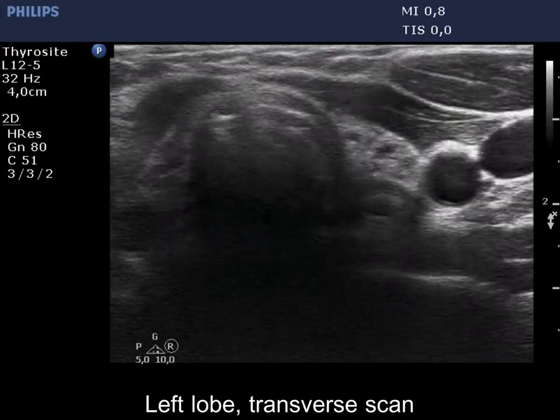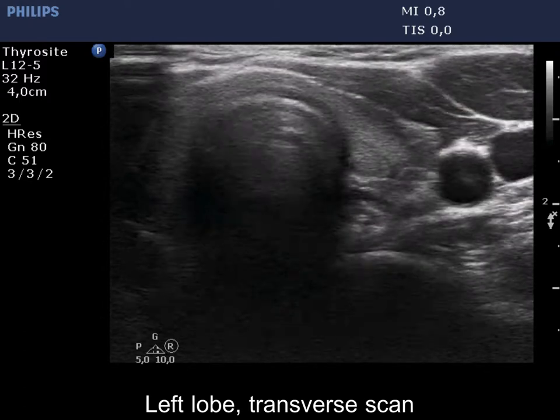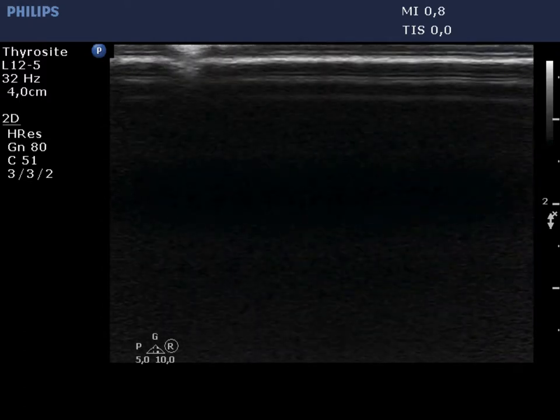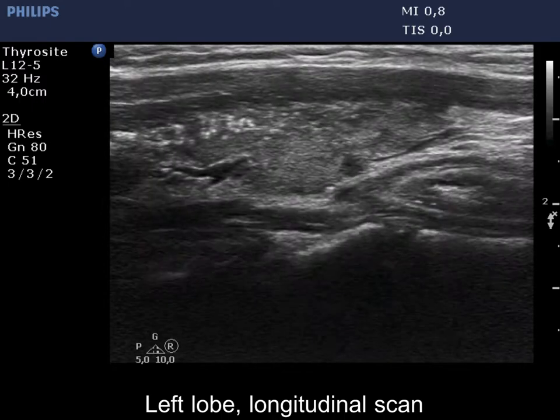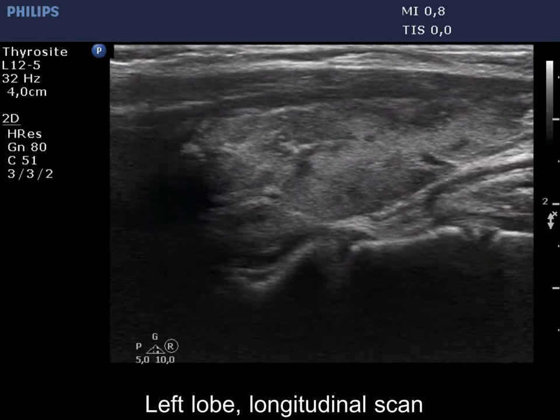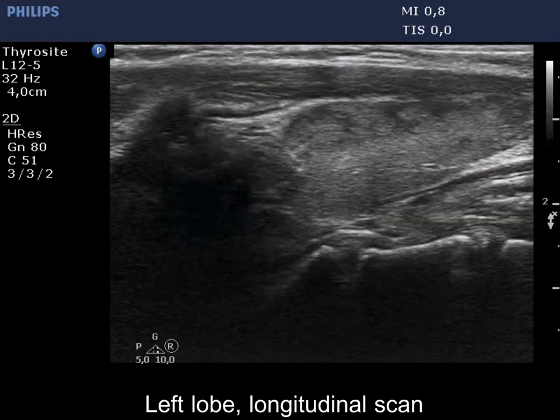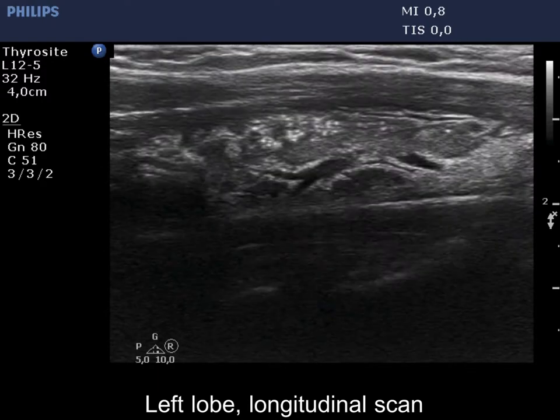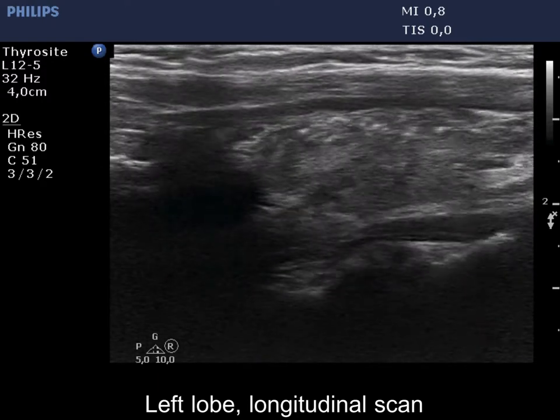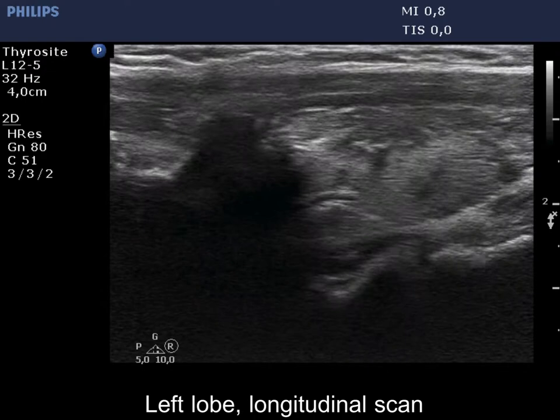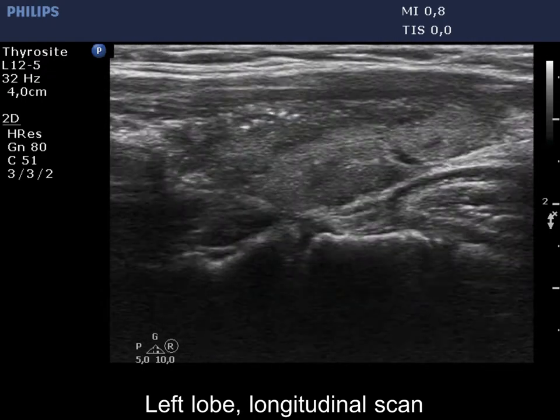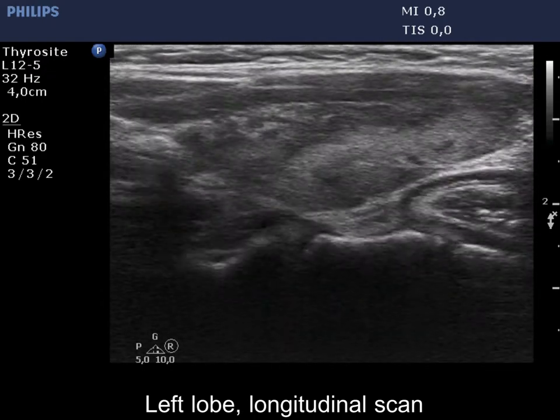The thyroid has numerous moderately hypoechoic areas corresponding to the underlying thyroiditis. There is a lesion in the ventral part which presents numerous microcalcifications. Note that there are a few microcalcifications quite far from the core of the lesion.